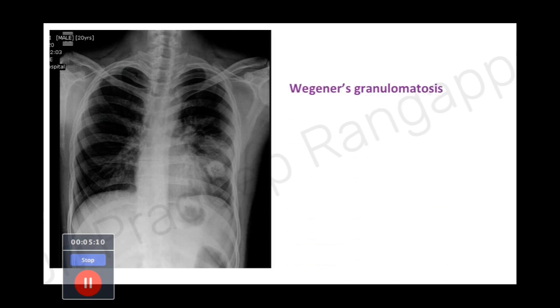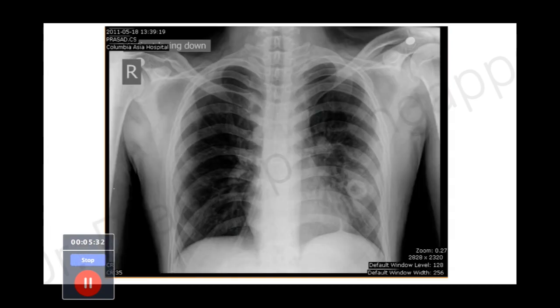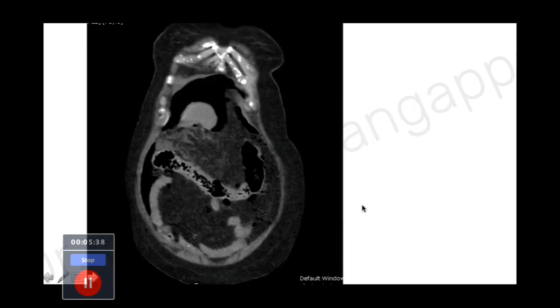This was Wegener's granulomatosis. The patient was on dialysis, had extensive hemoptysis, was intubated, and had a very aggressive course. He underwent cyclophosphamide, plasma exchange, and other treatments. The X-ray later evolved to show bilateral lung involvement, but initially this was a typical solitary nodule, with another evolving lesion also visible - very characteristic of Wegener's.